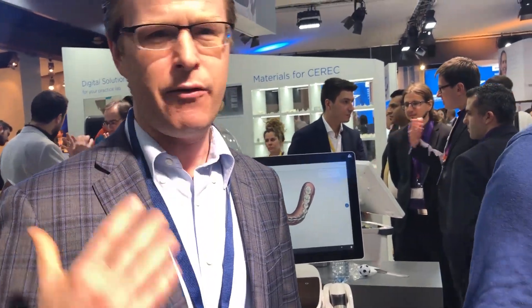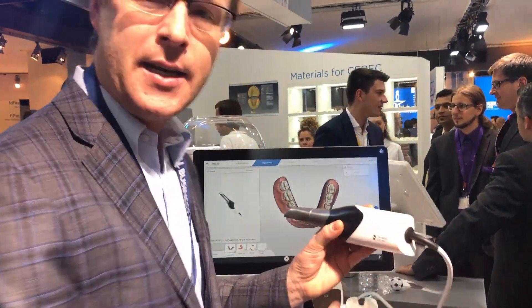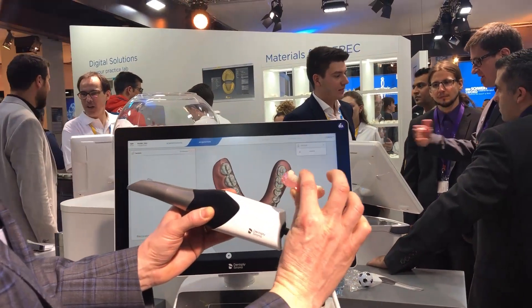It is a very nice evolutionary change from the different Omnicam systems and the previous CEREC scanners. Just kind of giving this thing a fair shake — it's a nice scanner. It scanned my denture 360 degrees pretty darn well.